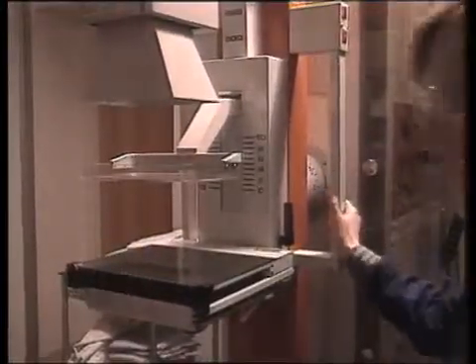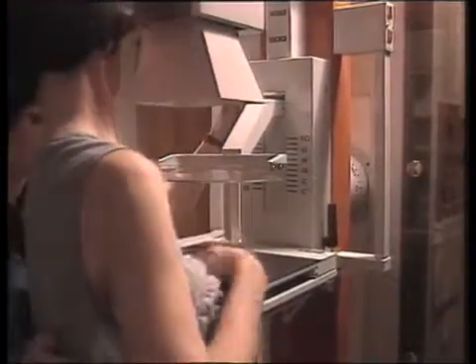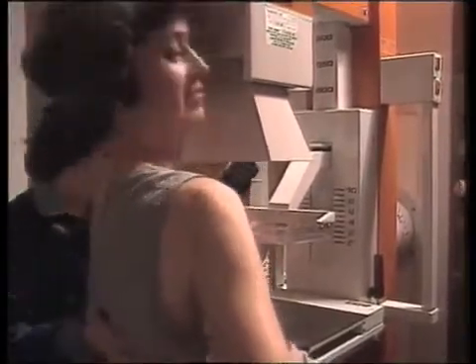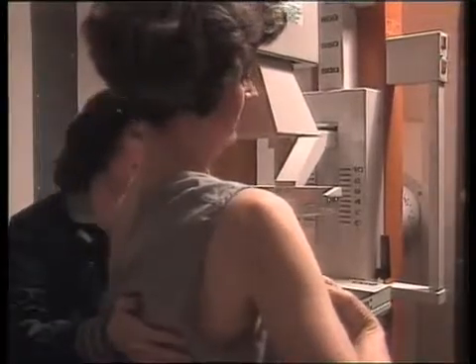Let me come around to here, over on this side. I'm going to step over here. You want to drop your gown again for me. I'm going to adjust this to your height, since you're kind of tall. All right, you stand straight for me — this will come to you. I'm going to lean in against the machine.